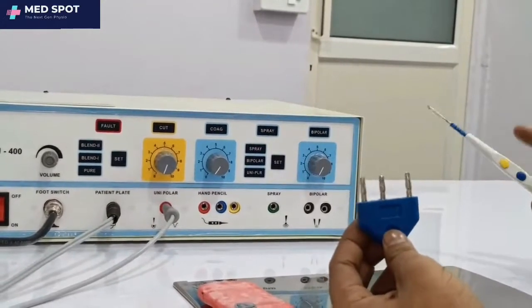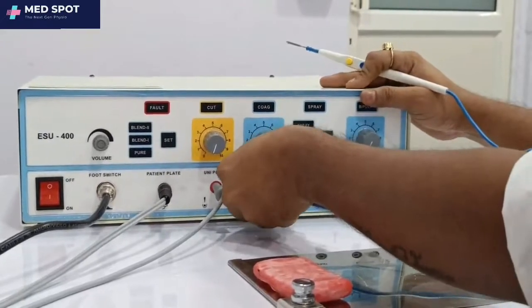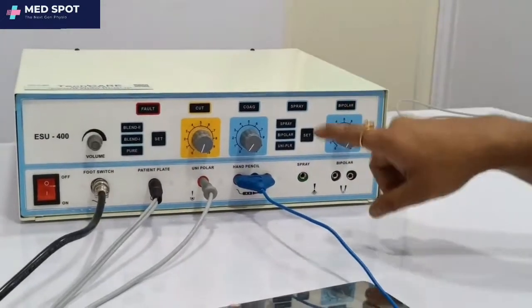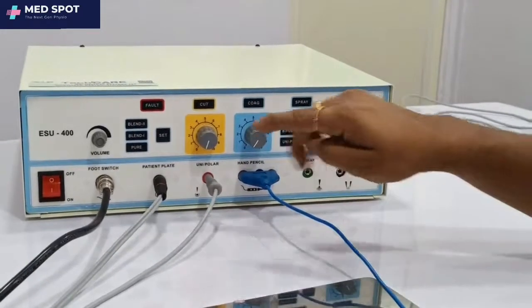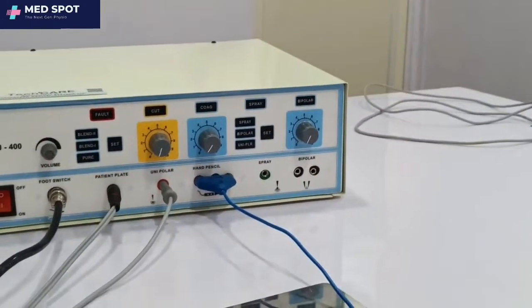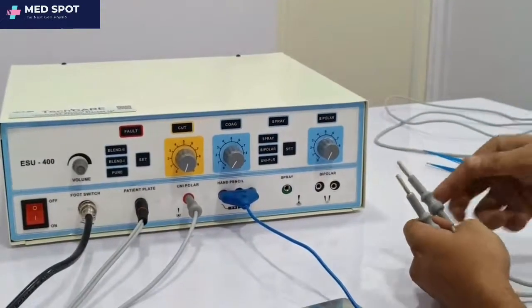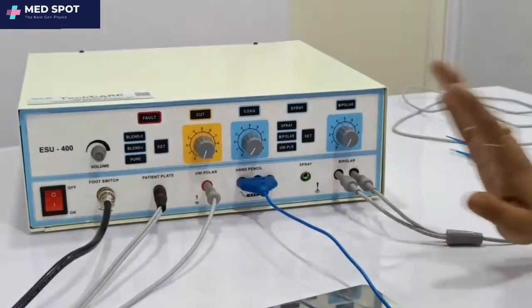The fourth accessory is the hand pencil. This is the hand pencil with cut and coag buttons, and this is its connector. This accessory is for spray — this pencil is also used for spray. And now the bipolar — the bipolar accessory is this. All accessories are now covered.